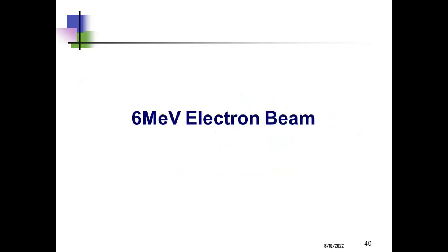So we have discussed till now 6 MV open beam and wedge 15, 6 MV. All the wedges are similar to what we have discussed. The procedure will be the same whether you are commissioning 6 MV or 15 MV, or wedge with 6 MV or wedge with 15 MV. We have discussed only one set of steps, for 6 MV in open and in wedge.